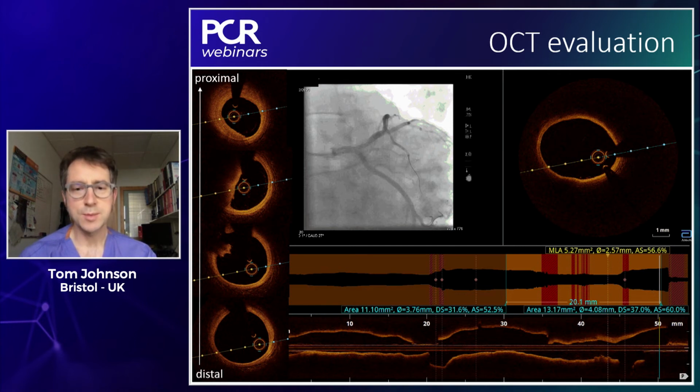There's always a temptation to think, well, let's avoid the left main, let's nail the ostium, let's stent just to the ostium of the vessel. And I think what Javier's slide from the EBC IVUS consensus shows is you will always be fooled, and there is always disease that extends back into the left main, or at least 2/3 of the time for sure. So more often than not, we should be considering protection of the left main rather than risking dissection and then difficulty in managing the most important element of this lesion.